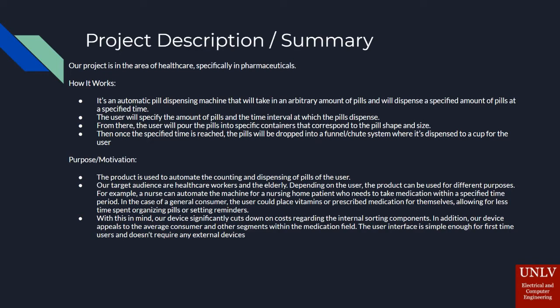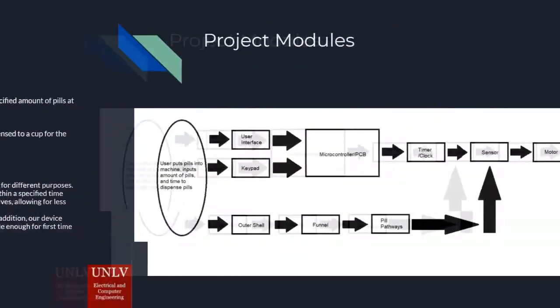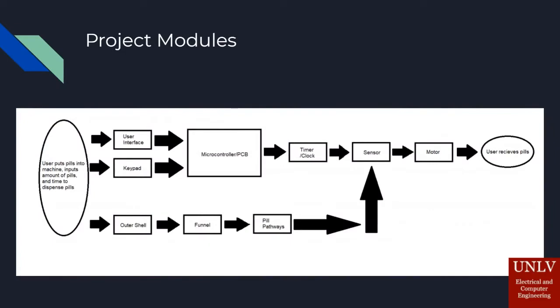With this in mind, our device significantly cuts down on costs regarding the internal sorting components, and in addition, our device appeals to the average consumer and other segments within the medication field. Our user interface is simple enough that any first-time users are able to use it and don't require any external devices. So here is our project modules.